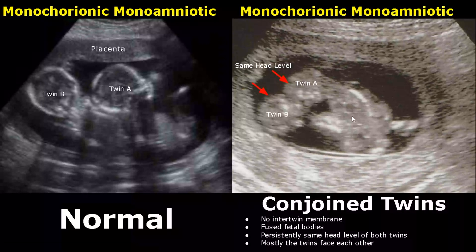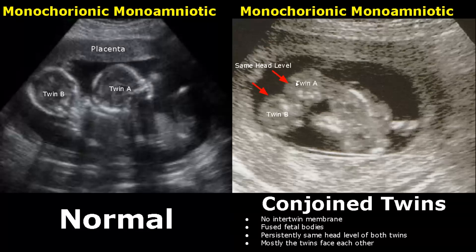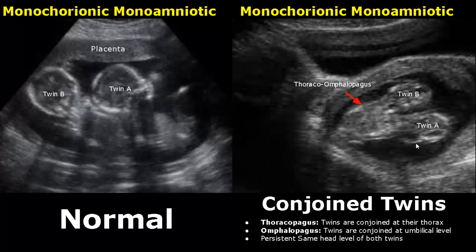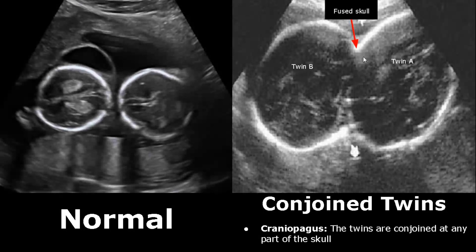Conjoined twins refer to fusion of fetal twins — the twins are attached to each other, and you can see the fusion of the chest and abdomen. The head level of both twins will persistently remain at the same level, and in most cases the twins will be facing each other. Thoracopagus refers to twins conjoined at the chest, and omphalopagus refers to twins conjoined at the abdomen. This image shows fusion of both chest and abdomen, so these are named thoracomphalopagus twins. Craniopagus refers to fusion of any part of the skull of the twins.